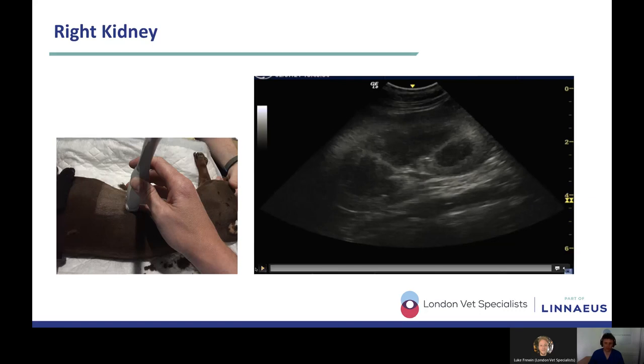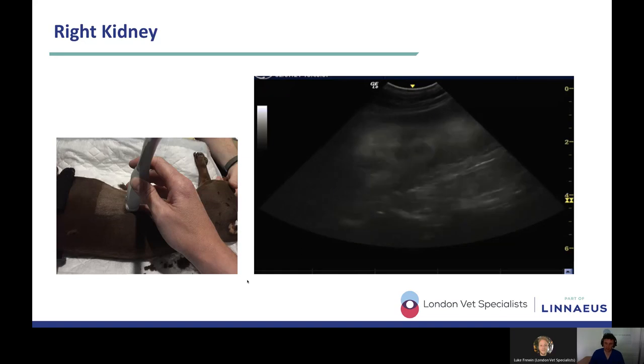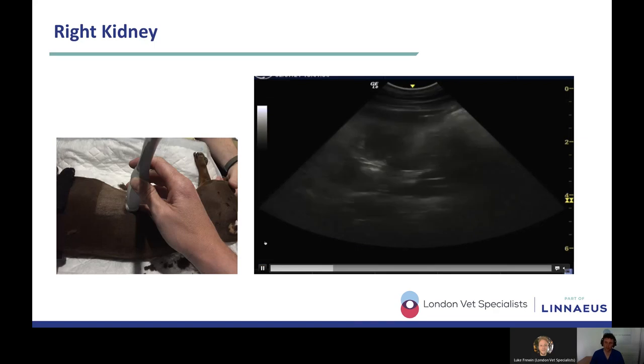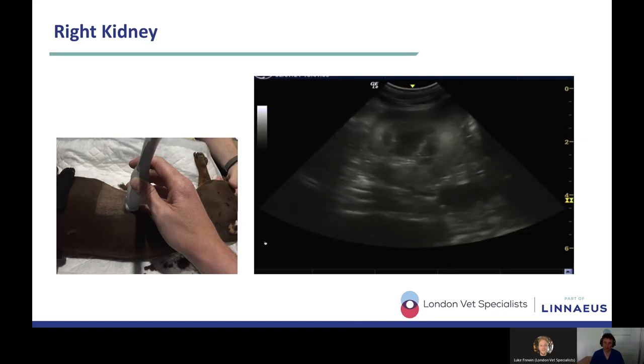So let's take a look at the right kidney in this patient. So this is what it looks like. Again, we've got a beautiful sagittal view of that right kidney. Again, we're looking at all the features that we should be looking at when examining the kidney. So it's kidney shaped, it's got beautiful smooth margins, looks like it's a normal size. It's got a bright cortex, a dark medulla, nice bright renal pelvis and renal pelvic fat, nice corticomedullary definition. So looks absolutely fine.